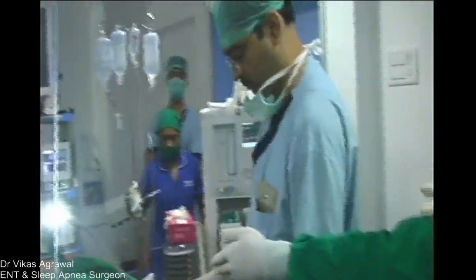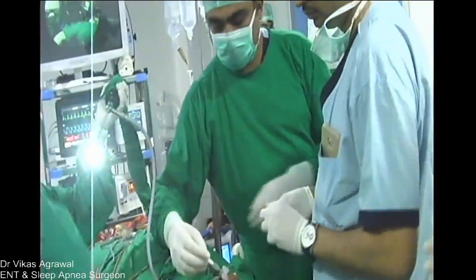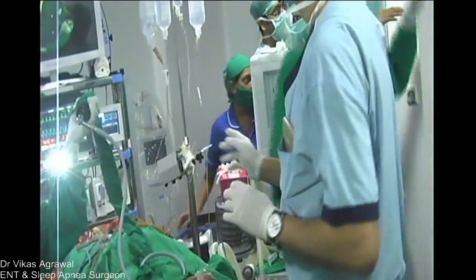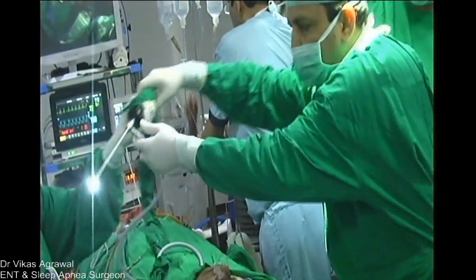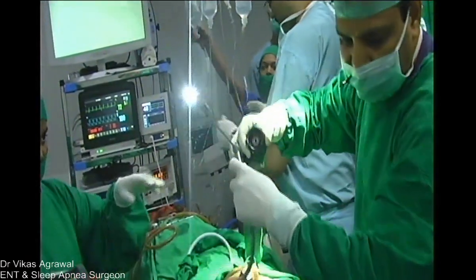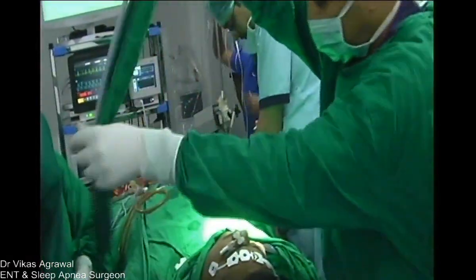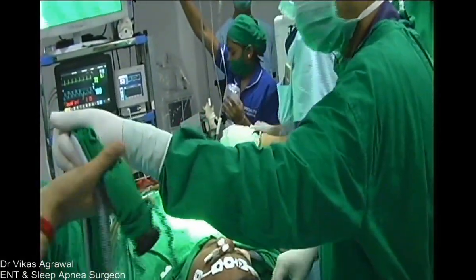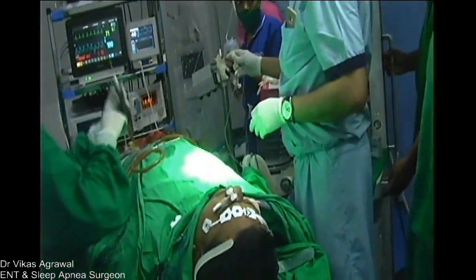Do all this, cut all this and stick it, stick it to the side, no problem. So now we are removing the endoscope and the camera. It's no more required, so that we'll clear up the space for Kalpesh to extubate. Why are you putting so much light? No need for more light. Fine. It will glare, no?